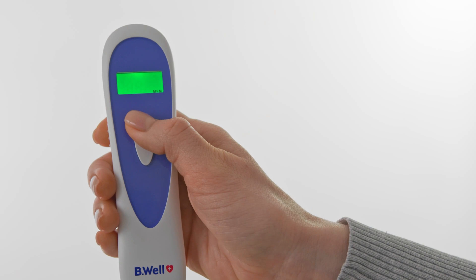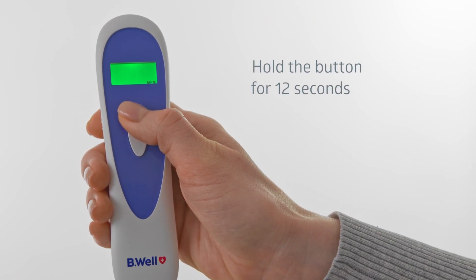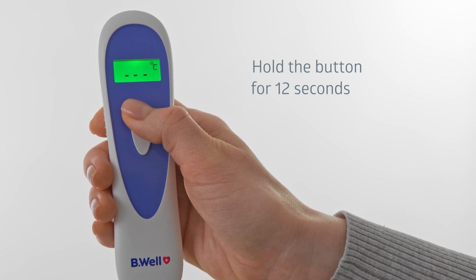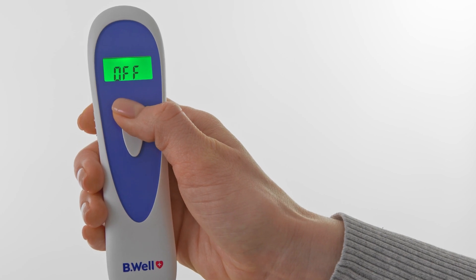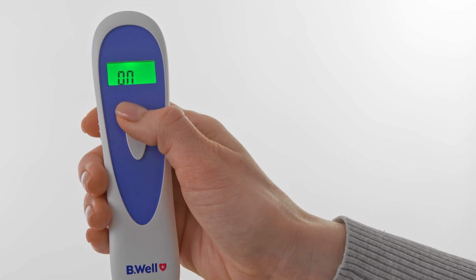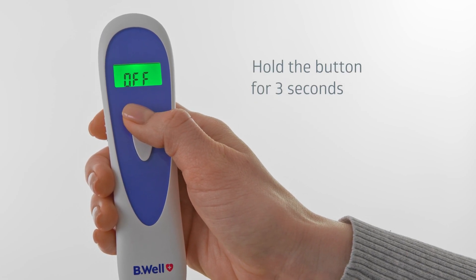Turn the thermometer off in order to turn the beeps off. Press and hold the on button for 12 seconds until the display shows the beep setting. Press the on button again to turn the beeps on or off, then press and hold the on button for 3 seconds to save the change.